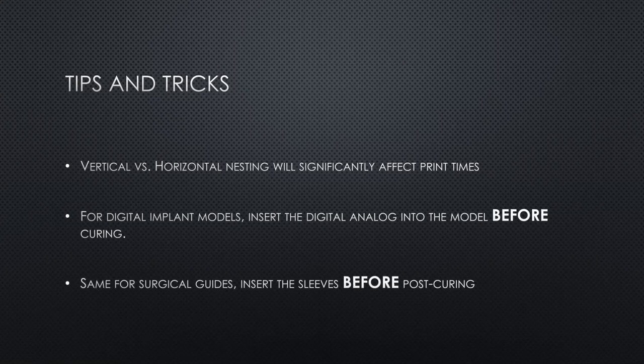For digital implant models, what I recommend is inserting the digital analog into the model before curing. The same goes for surgical guides. Make sure that you're inserting the sleeves before post-curing. There is a little bit of shrinkage, so it might make it too tight where that analog won't be able to fit in. So with that, I think we can move on to the Q&A session.